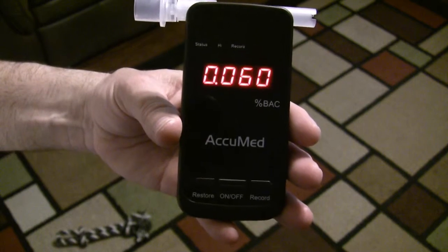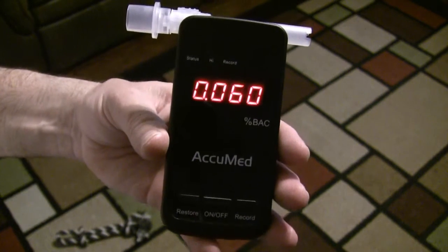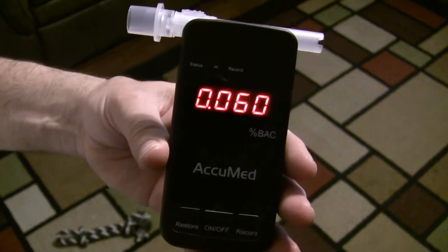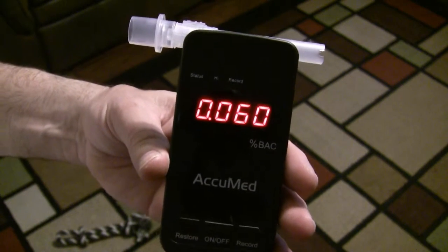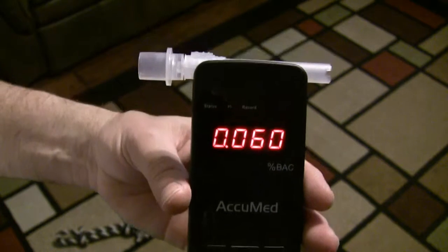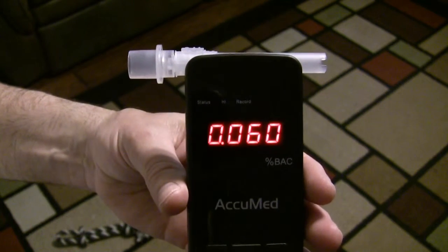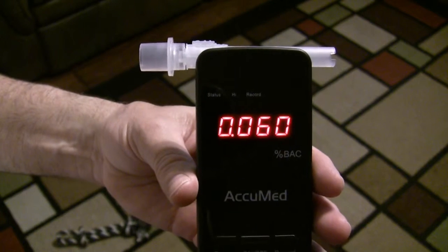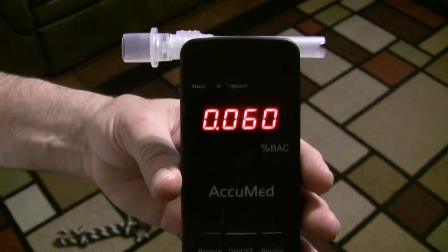So I am 0.06. Now that was two beers and about a quarter to a half of a margarita that was left over from last night sitting in the refrigerator. But that was over about an hour period of time so they were fairly close together. And that actually is still legal in California, so I can legally drive.